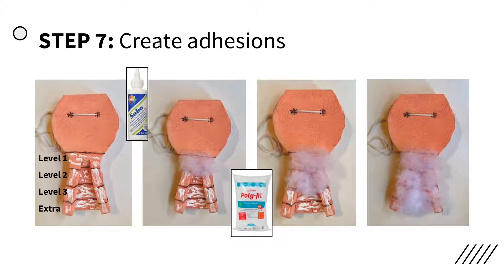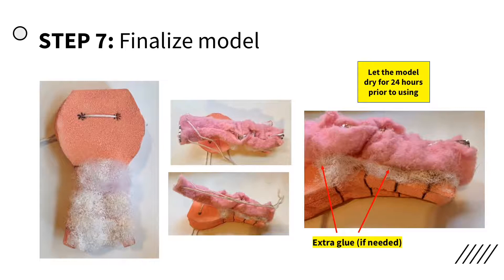Add a layer of Plaid Delta 108 Sobo Premium Craft and Fabric Glue to the model, gradually increasing the amount of glue used from level 1 to level 3. Use the same amount of glue in the final extra section to keep the pieces attached after dissection. Ball up polyfill polyester fiberfill loosely for level 1 and place it on the wet Sobo glue. Ball up fiberfill with slightly greater density for level 2, and densely and compactly for level 3 and the extra section. Spray the fiberfill with the 3M Purpose 45 spray adhesive using increasingly more glue in each level, creating different levels of difficulty. The amount of glue used in each section can be adjusted depending on desired difficulty.